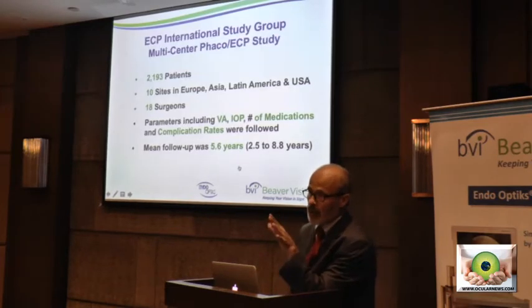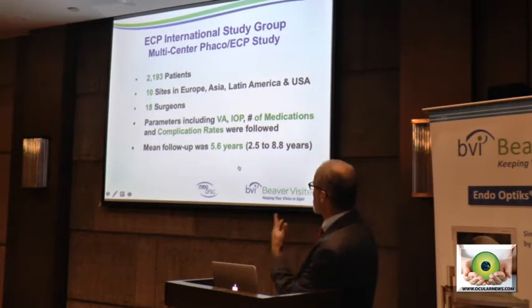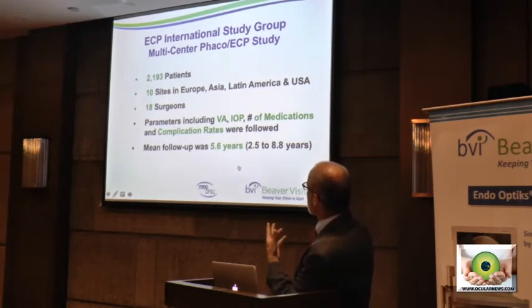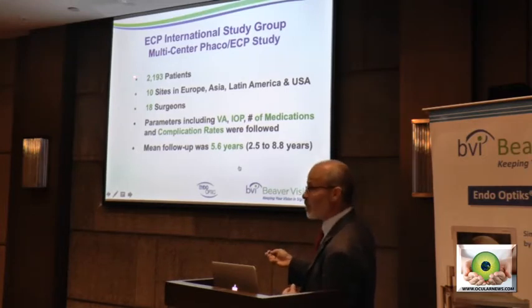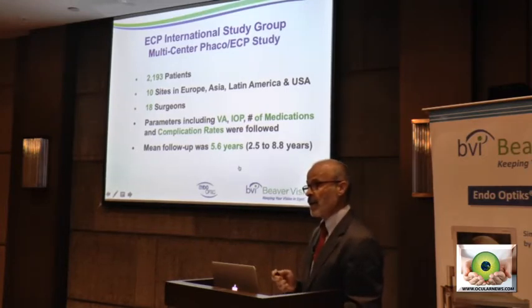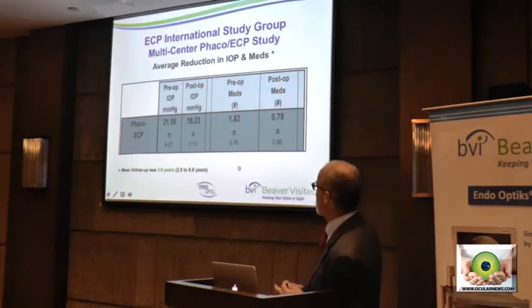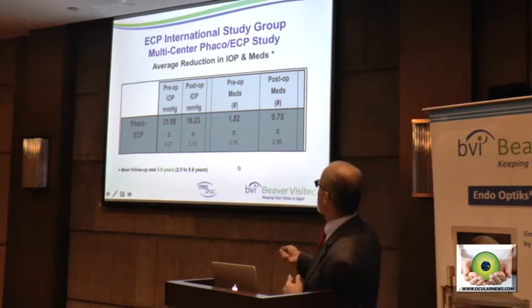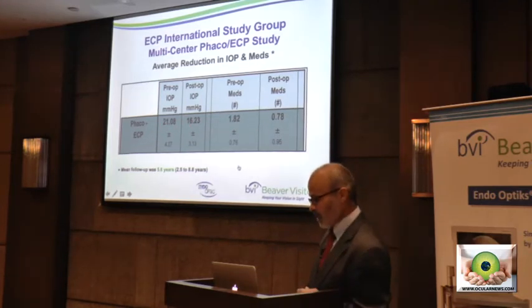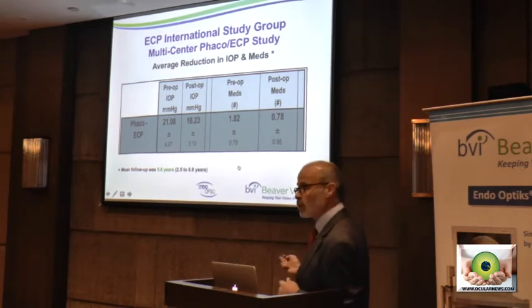So I'm just going to go through quickly a couple of them, and then we'll move on to other applications. But these are kind of typical results. This is another large multicenter study. And again, if you look at these numbers, you rarely see that in glaucoma studies for MIGS devices. So kind of typical results, as illustrated earlier, with concurrent reductions of medications. The compliance of medications is a worldwide problem.